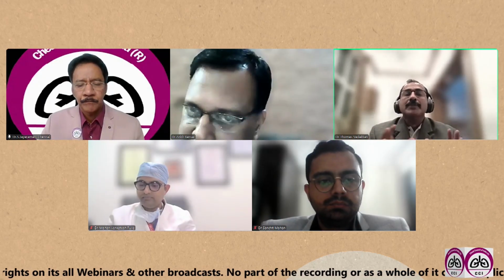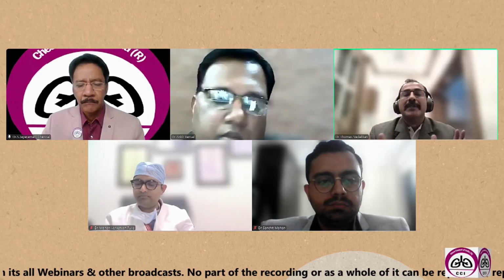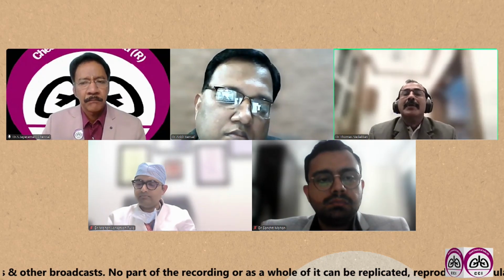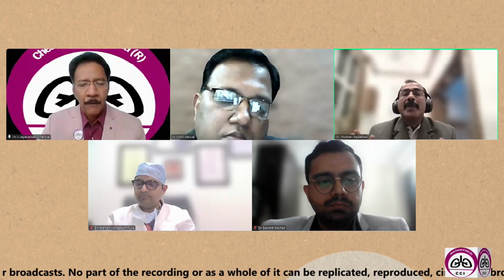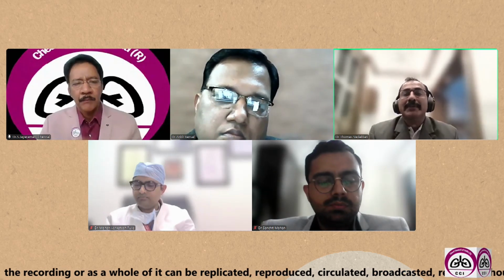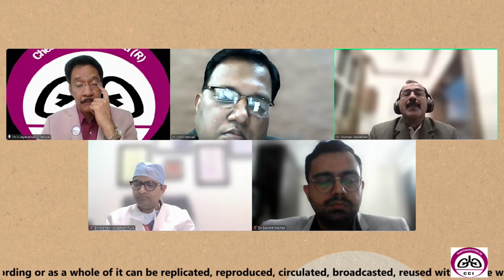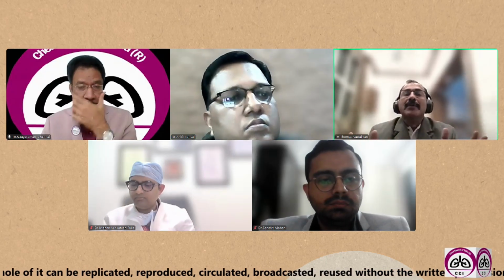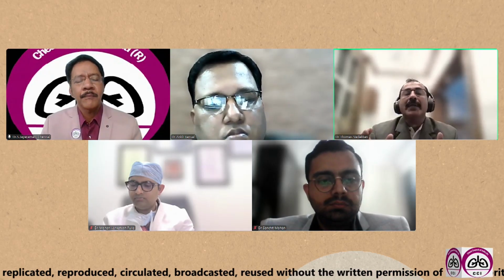Also, the aorta, we can just look at the aorta. What is happening? Is there any aneurysmal swelling? Is there any clot inside? Which can be really appreciated. And also the pulmonary artery. I have seen many case reports where they have done EBUS to document central pulmonary thromboembolism in a few cases. So we can visualize the vessels, and also search for anything in the vessel, which is also important.